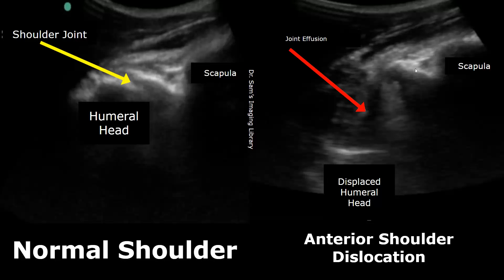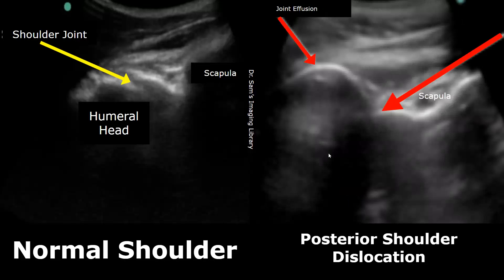This is a case of an anterior shoulder dislocation. We will see joint effusion and a large gap between the humeral head and the scapula — the humeral head is displaced anteriorly. The scapula can be seen up here and the humeral head down here in the image. This is an image of posterior shoulder dislocation.